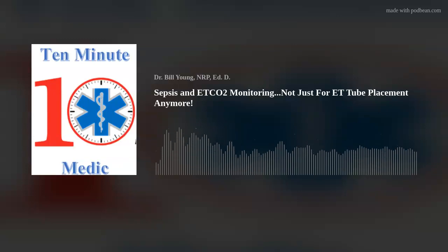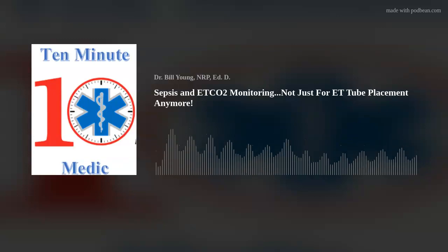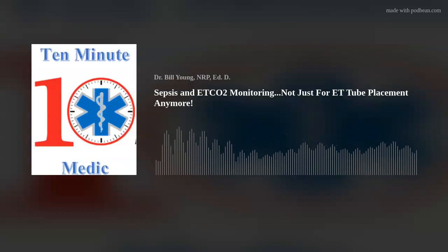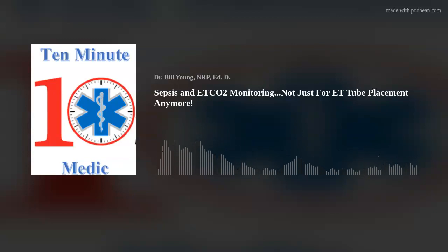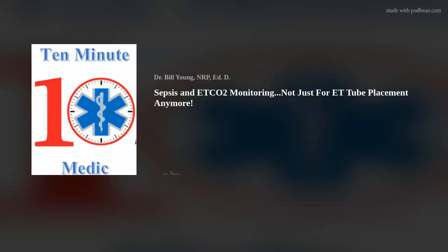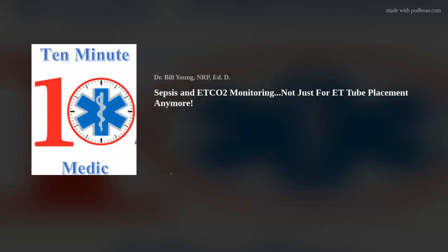The clinical application of end-tidal CO2 monitoring in sepsis is vast and critically important. As a non-invasive, real-time tool, and I want to emphasize the real-time feedback that it gives you, it provides paramedics with vital information for early detection, resuscitation monitoring, ventilation strategy guidance, and prognostication in septic patients. Its integration into your pre-hospital sepsis management protocols can enhance the quality of care provided to these critically ill patients.